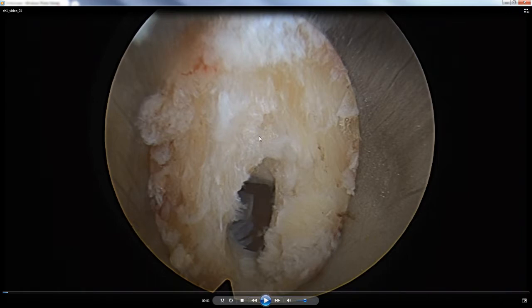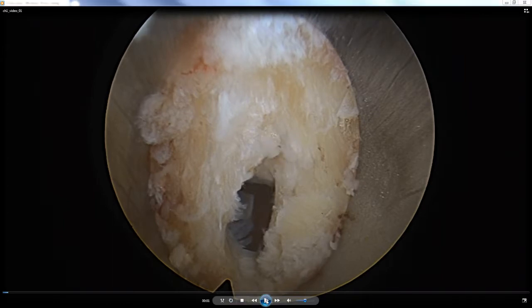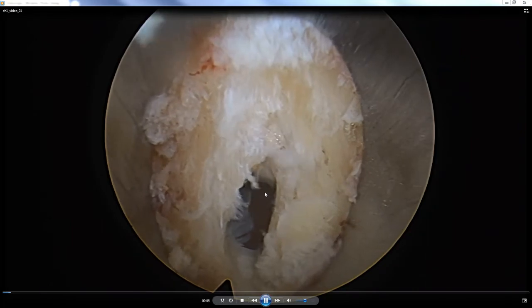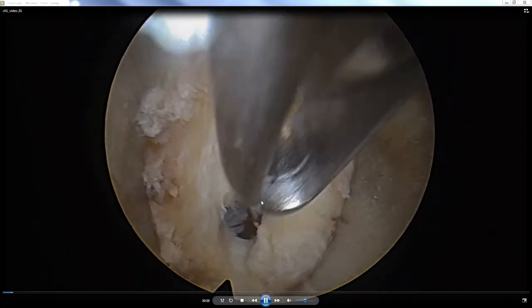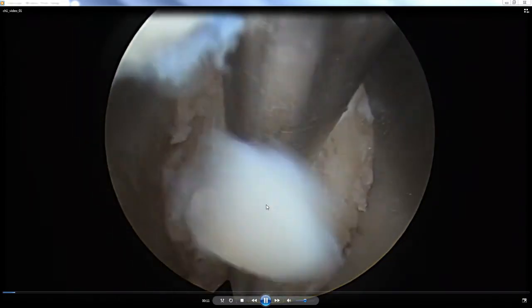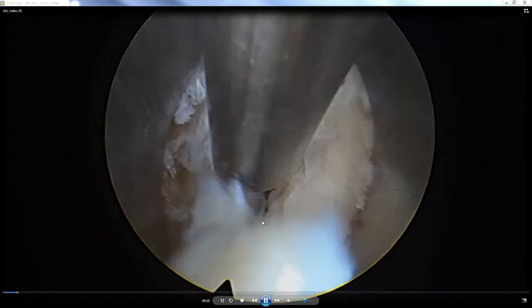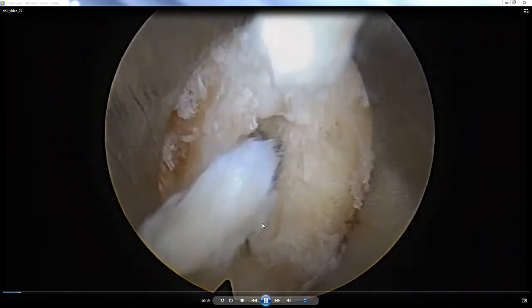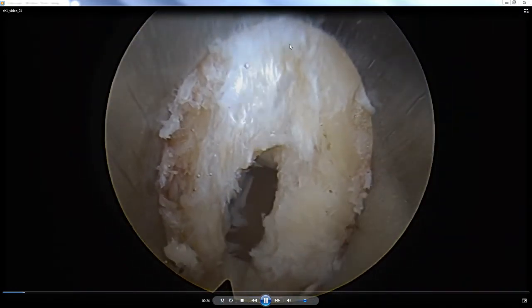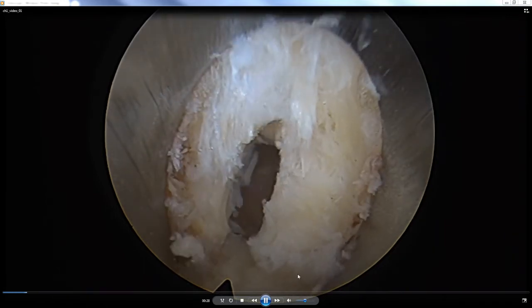This is the very first view that I get. I started the camera just a couple of seconds after I started making snips in the ligamentum flavum. The yellow area you see here is the ligamentum flavum, surrounded by the metal tube that I'm operating through — about the size of a number two pencil. I've made a couple of snips with my microscopic scissors so the spinal canal is starting to come into view. For reference, lateral is at the bottom of the screen, medial is at the top, the patient's head is to the left, and the feet are to the right.